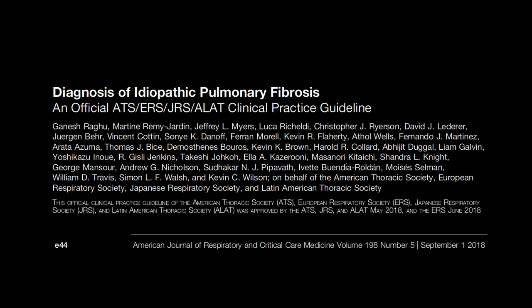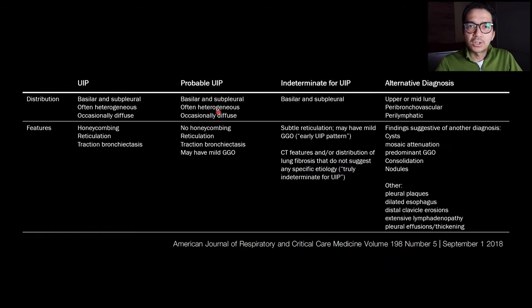Let's start with the radiologic diagnosis of UIP. This is a consensus statement put out by the American Thoracic Society, the European Respiratory Society, the Japanese Respiratory Society, and the Latin American Thoracic Society. It was a clinical practice guideline about the diagnosis of IPF. One of the useful tools in this article was a table with guidelines on how to diagnose UIP from a chest CT.